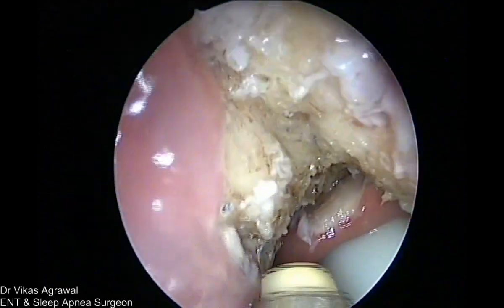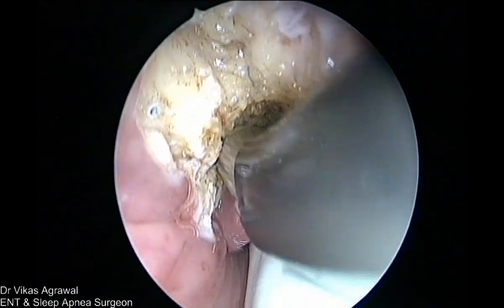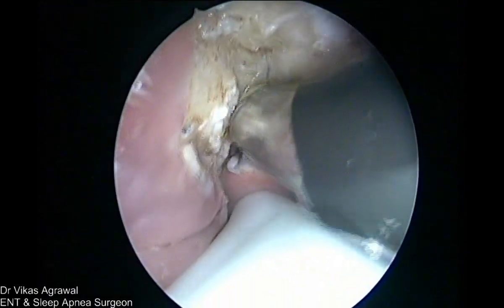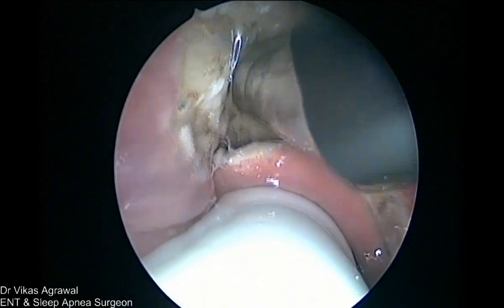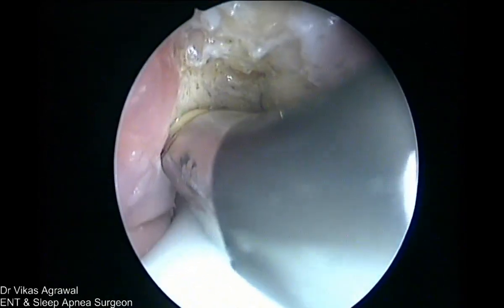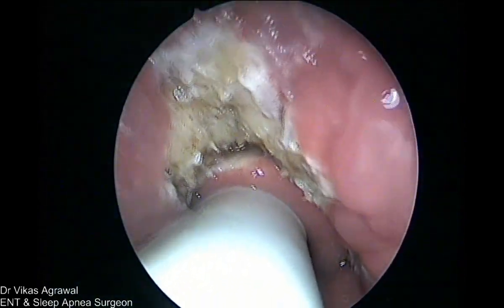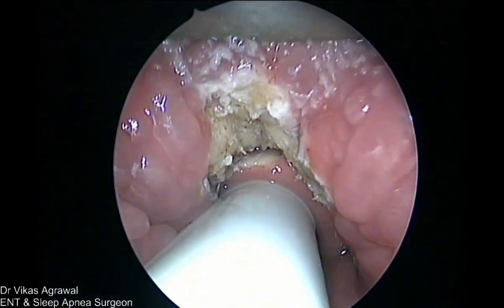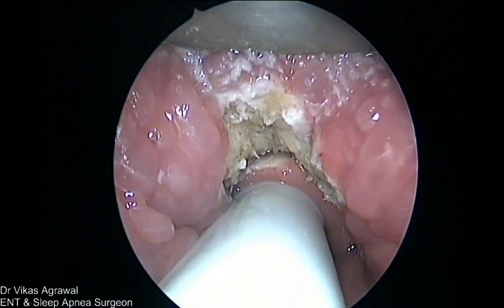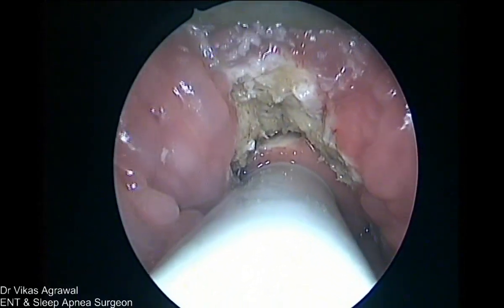Excellent. There is no bleeding, and this surgery is going to help him, I would say, by 70 to 80%, not 100%. If I try to get a 100% result, I'll get more complications. We have not gone deep into the muscles, so there is no chance of a big vessel opening up anytime. Now what I'm doing is I'm just putting a gauze, curved artery. I'm just putting a little bit of Sepguard, a hemostatic agent, for half a minute.